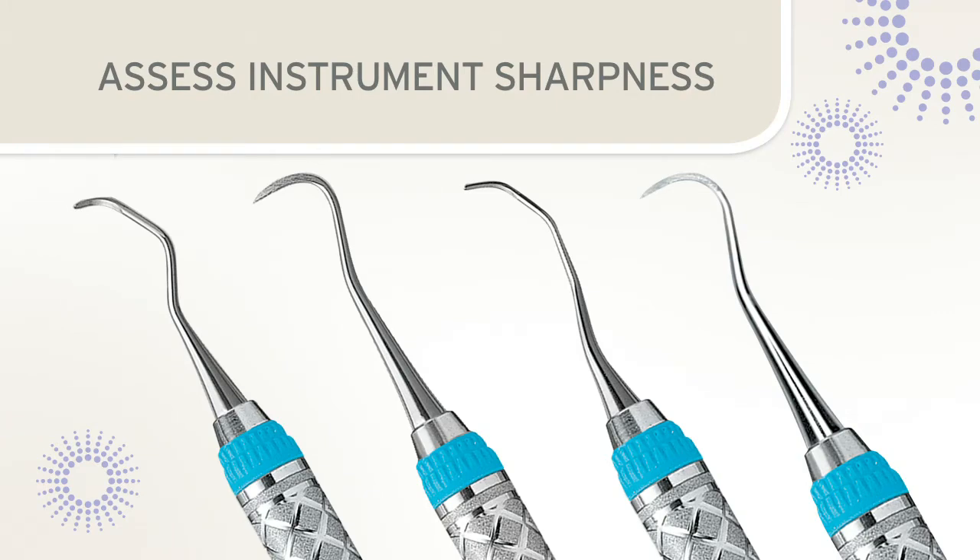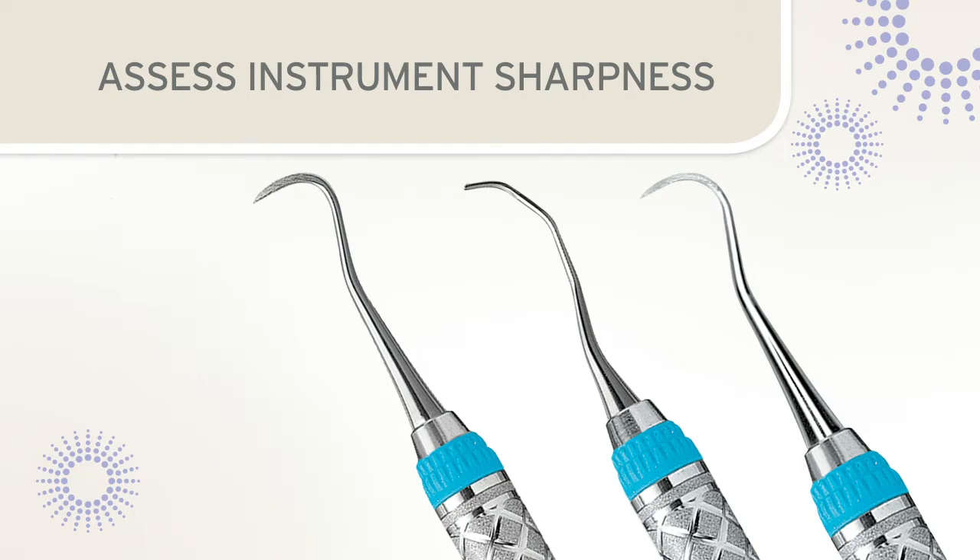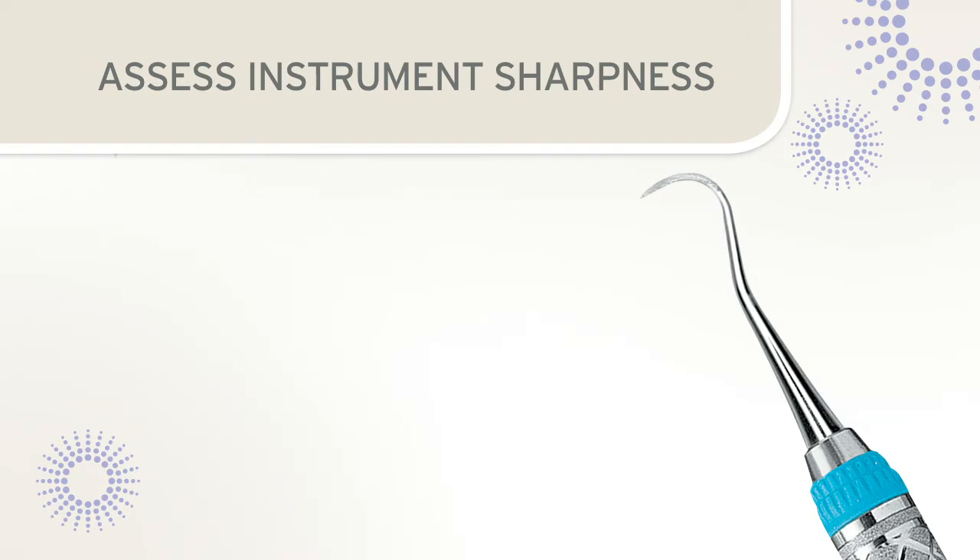After sharpening, it is vital to evaluate whether the sharpening objectives have been accomplished. Two methods are available to determine the condition of the instrument blade: the visual inspection or glare test, and the plastic test stick.